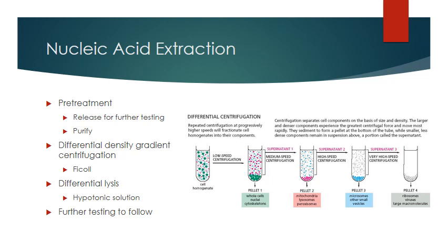There's a lot of processes here that sound like they're the whole test. But like when a doctor orders PCR, that's kind of limited. He doesn't want you to just replicate a bunch of genes. He wants you to do something with that afterwards. So PCR is actually a misnomer for what we're going to be doing. PCR is only a part of what we're going to be doing in this entire process. And all of it needs to start with nucleic acid extraction.